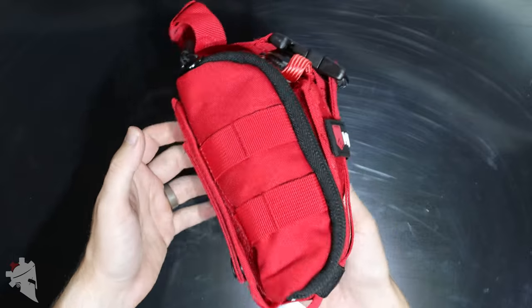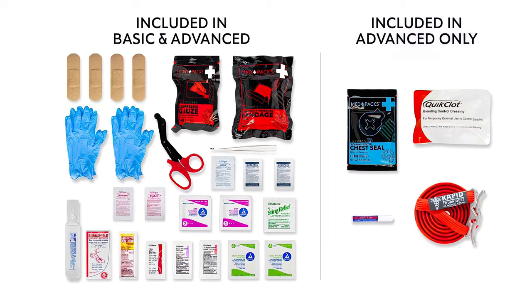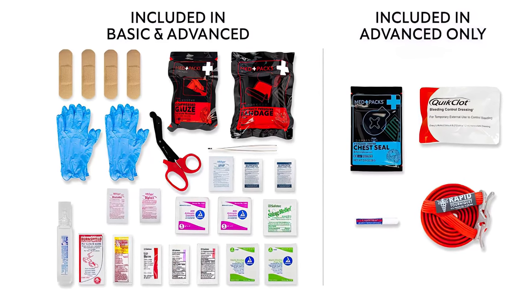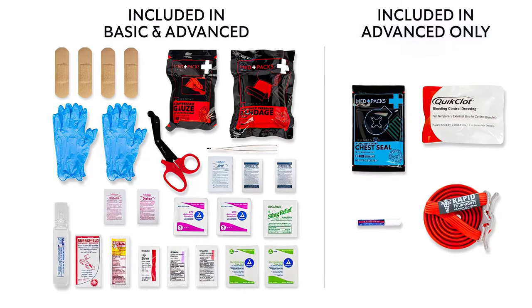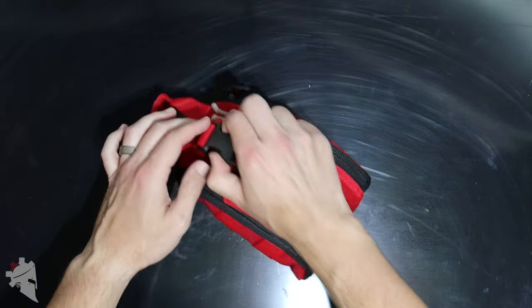This is the MyMedic Range Medic Advanced. There are a couple of pieces of medical gear in here that do not come with the non-advanced version because they require a little bit of specialized training to use correctly and safely. Let's get into this and see what it comes with.